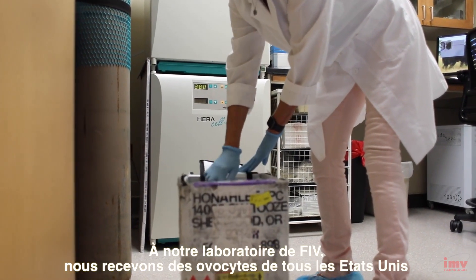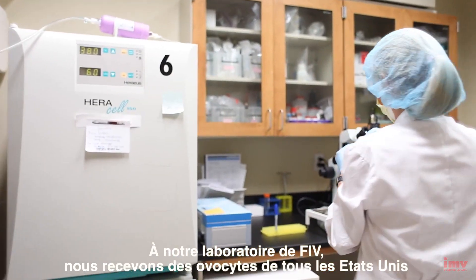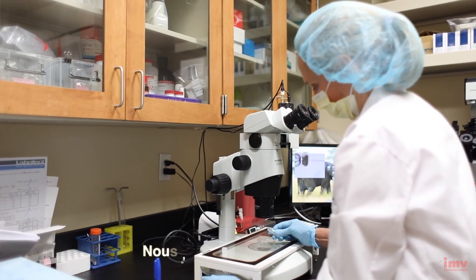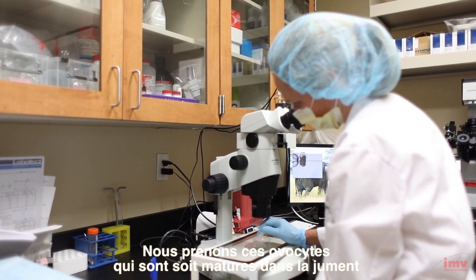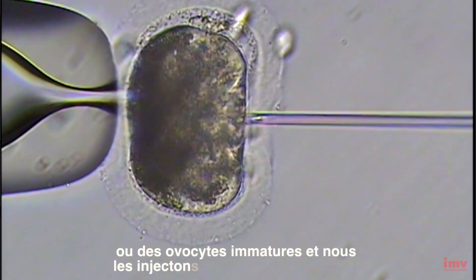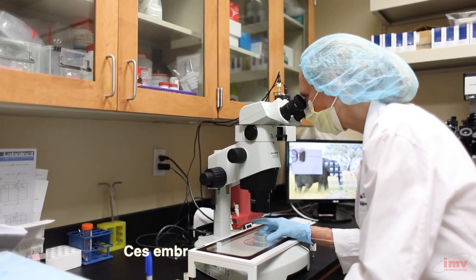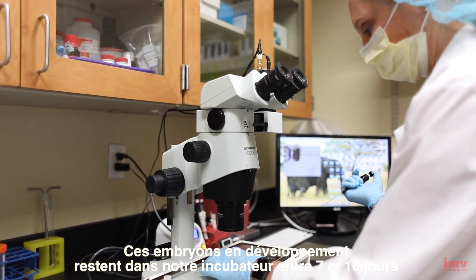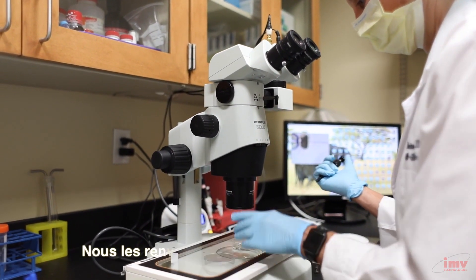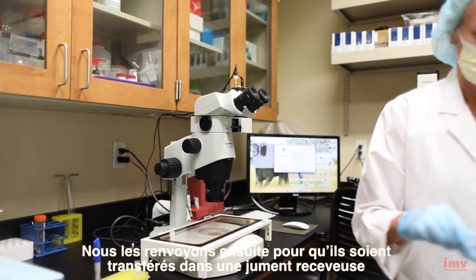At our equine IVF lab, we receive oocytes from veterinarians from all over the United States. We take those oocytes, which are either matured in the mare or immature oocytes, and we inject them with a single sperm. Those developing embryos are in our incubator for seven to ten days, then we ship them back fresh and they are transferred into a surrogate mare.